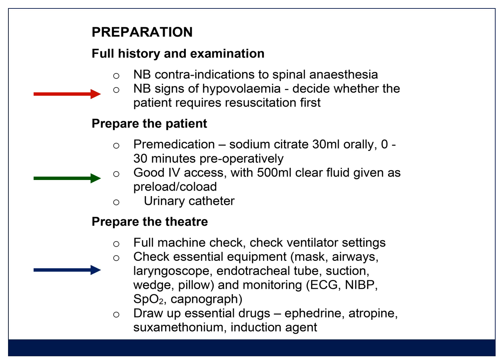And the third thing is, notice that in the essential equipment, there's a pillow, and the pillow is an essential piece of equipment that you're going to use to position the patient correctly, and you need access to pillows in obstetric theatres.